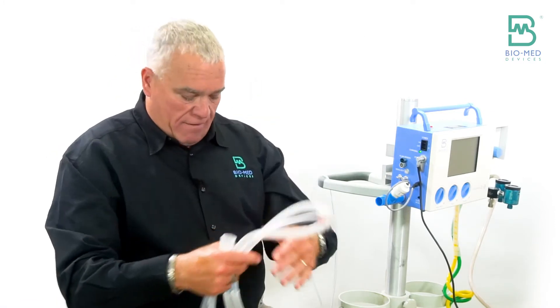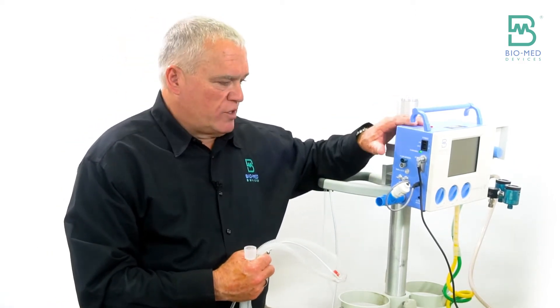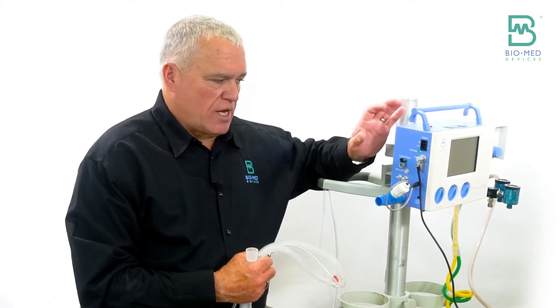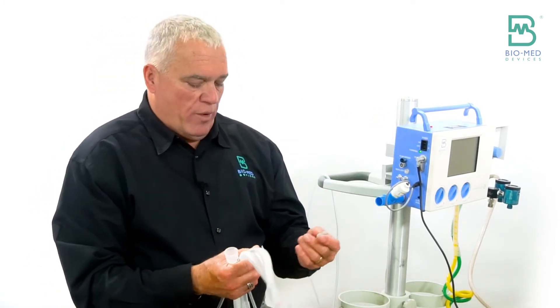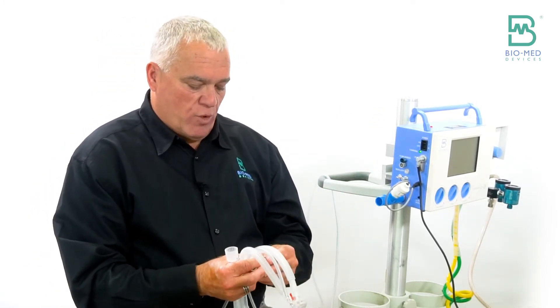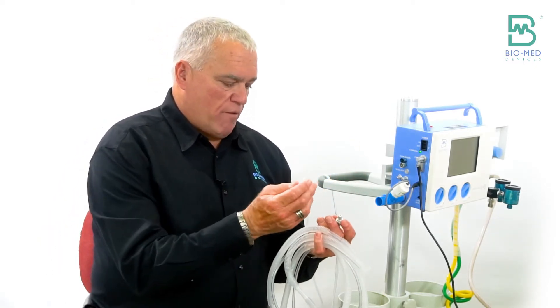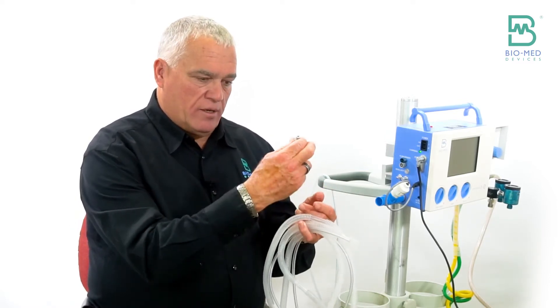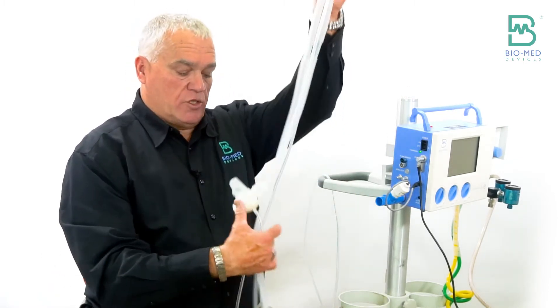We actually have a conversion kit. A lot of times what people are doing is ordering the standalone to be used with the GE Shuttle, but they also have transport incubators where they go outside the hospital and they don't want to have to buy two different circuits. So what we did is came up with our 2210 conversion kit, which will literally replace the hose barbed fitting on the built-in version and the pressure line so that they can use this same circuit for both.